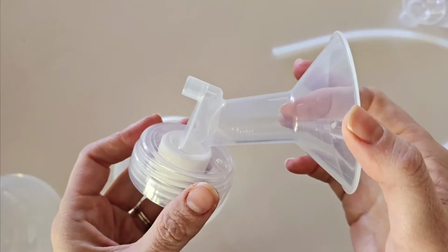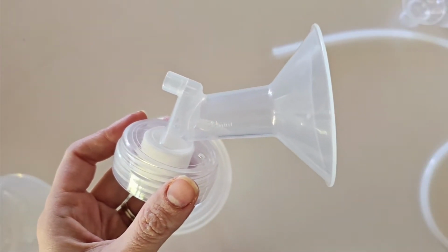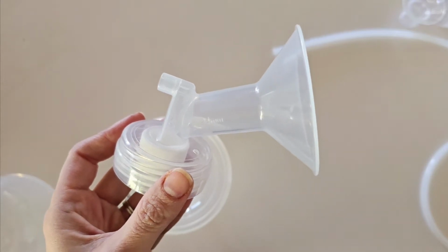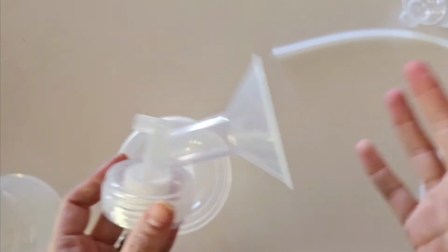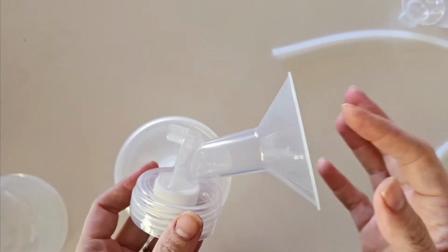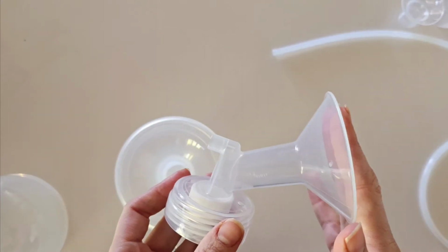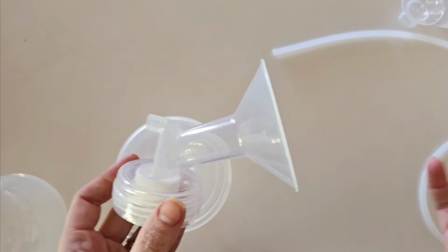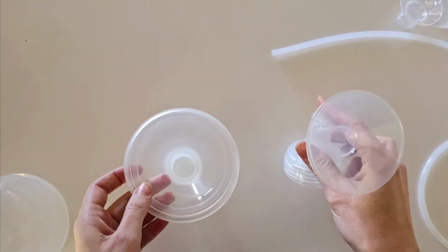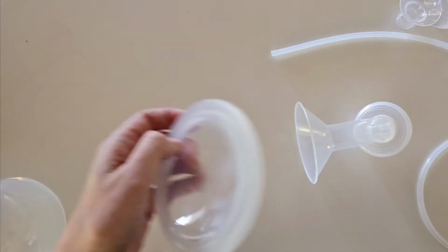And again, too large, you're also going to have your areola getting pulled in, and that's not going to be very comfortable at all. So I really stress that it's important to get the right sizing for you to make sure that your pumping session is as comfortable as possible. So how do we find our nipple size? There are a couple of ways.